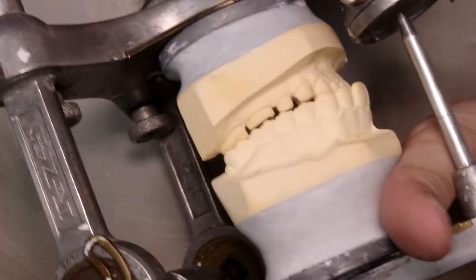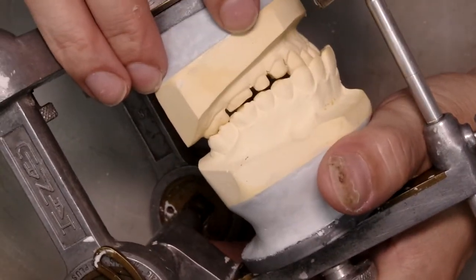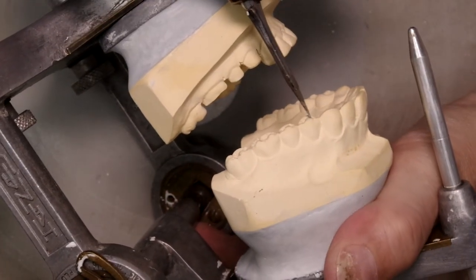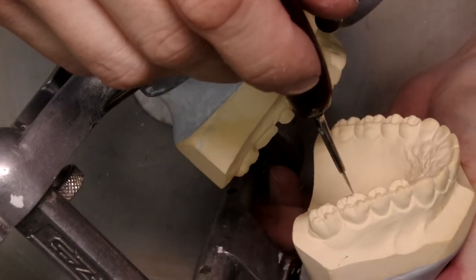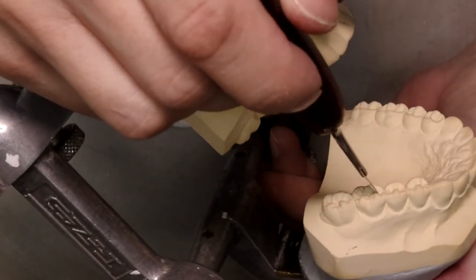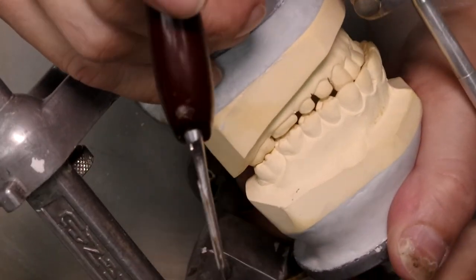On one side, we're going to do tooth-to-tooth occlusion, or the way I like to call it, cusp-to-fossa occlusion, because each cusp is going to go into the opposing fossa — mesial fossa here, mesial fossa there, and then there's a mesial fossa, central fossa, and distal fossa. So that's what we're going to concern ourselves with right now.